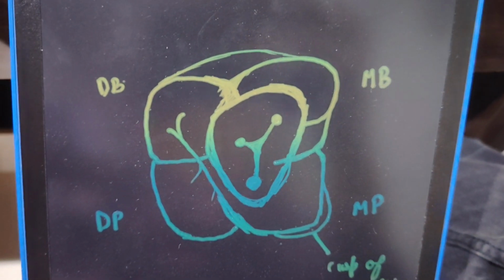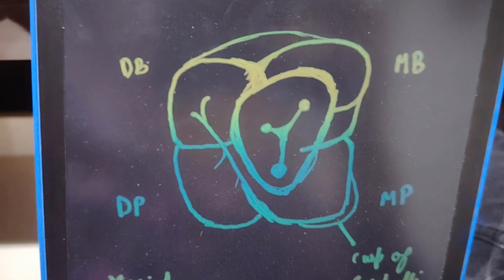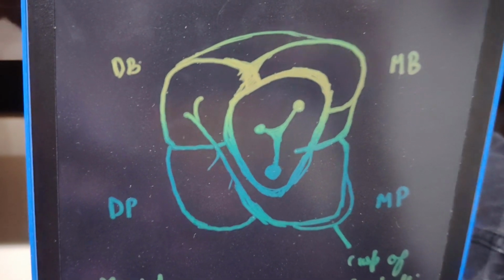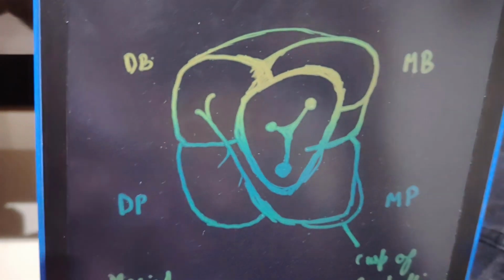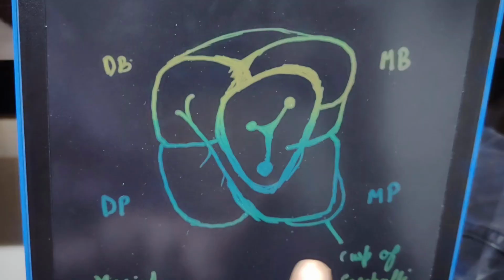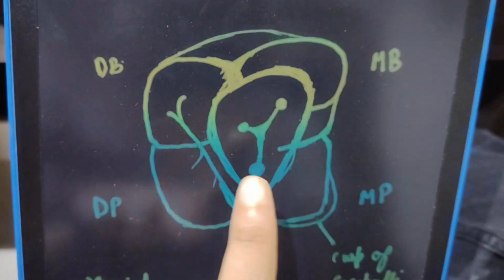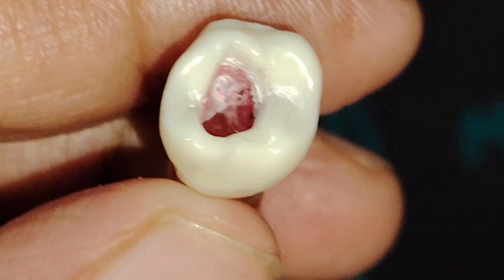And as we know, RCT is a very conservative kind of treatment. We don't want excess tooth removal, especially on the structures that provide strength, so we'll not include any ridges. Here is where we will get the canal locations.